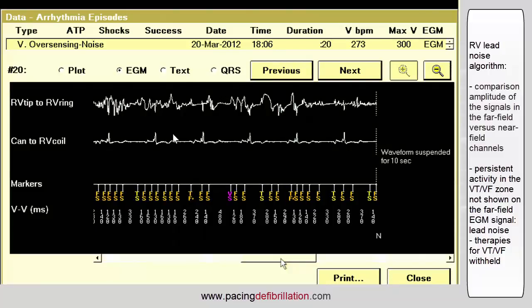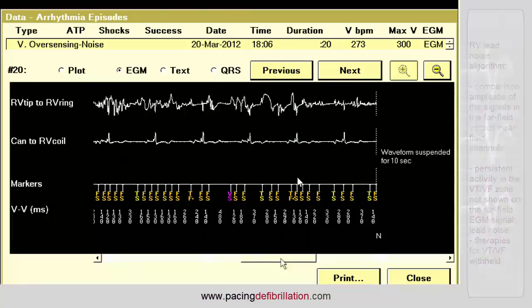Every sequence of 12 peak-to-peak amplitudes is analyzed through a sliding window. When the number of intervals to detect VT or VF is reached, if 3 of the 12 last sequences are classified as noise, the detection is then interrupted. The therapies are then not delivered and an alert is triggered. The device will sound every 4 hours until the device is interrogated by a programmer. If remote monitoring is on in this patient, then the device also attempts to send a wireless transmission to a CareLink monitor.